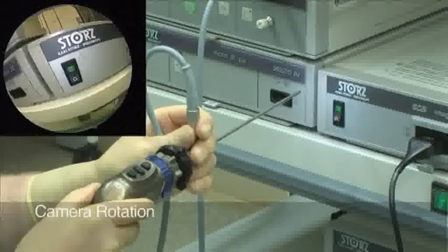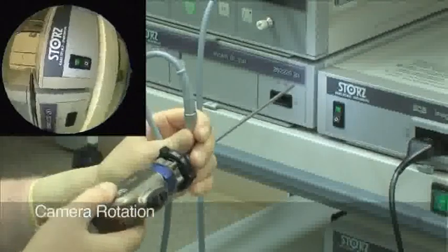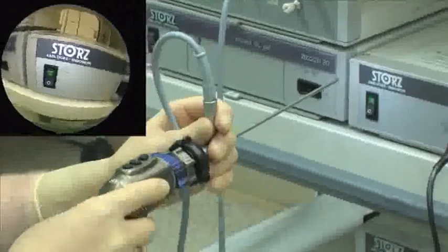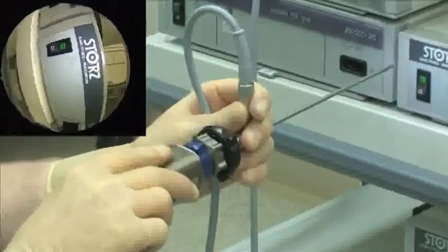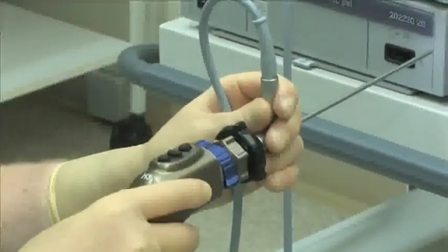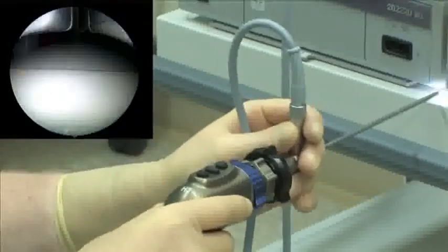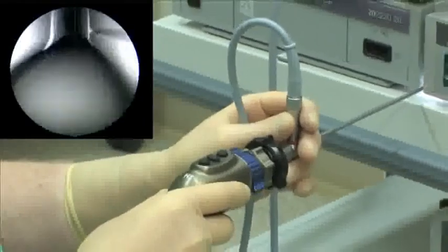By rotating the camera, the picture on the monitor can be turned, while the endoscope remains in a constant position. In this case, if we have a sufficient field of view, orientation through the script on the arthroscopic tower is still possible. Camera rotation within a confined space is now shown.